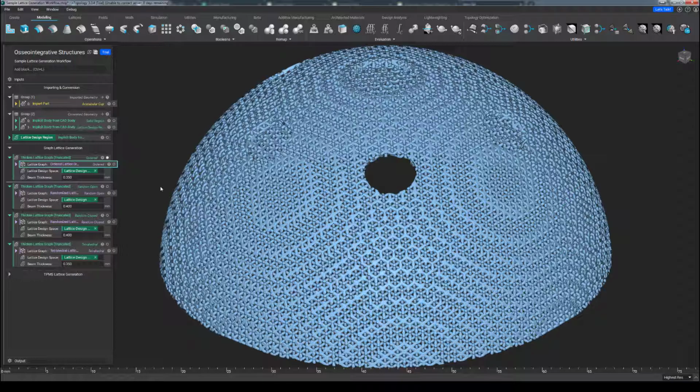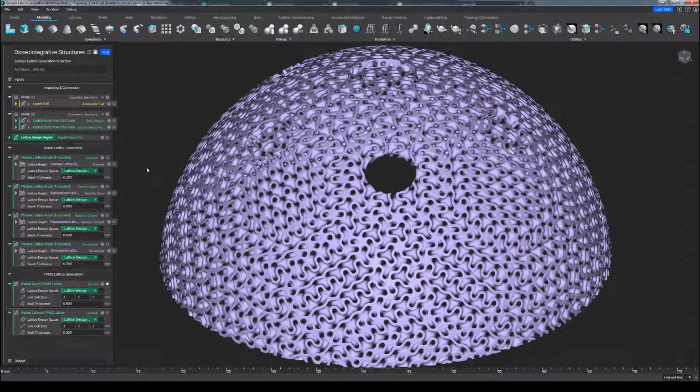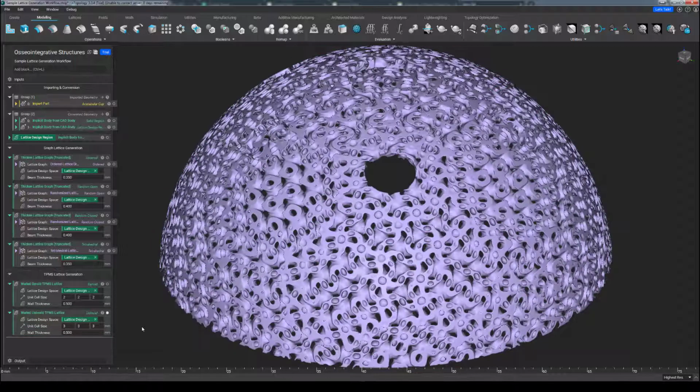Before we close out, I do want to indicate that TPMS structures like the wall gyroid can still very much be considered valuable osseointegrative structures depending on how exploratory you are willing to be with characterization. However, it is generated using only one custom block instead of the two that we typically use for graph lattices. The reason for this is because there is no node beam representation or graph for TPMS structures. They simply start as implicit models so that no thickening is really necessary. All the user needs is to dictate a unit cell size and a target wall thickness, and the lattice structures like gyroid or lidinoid will just appear.